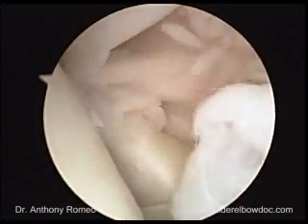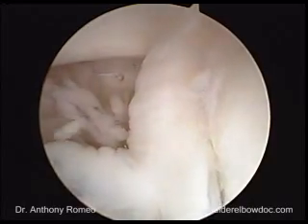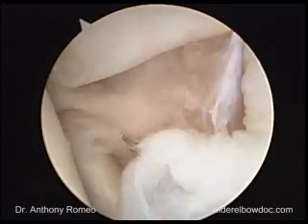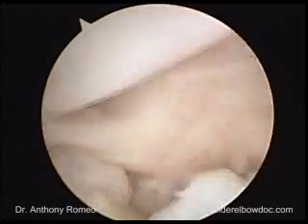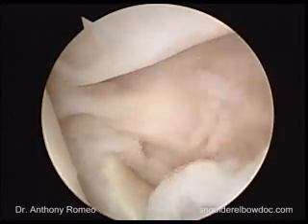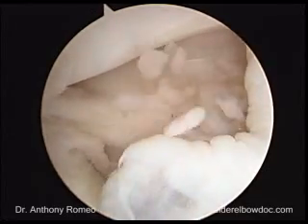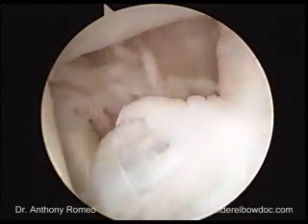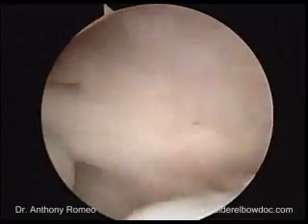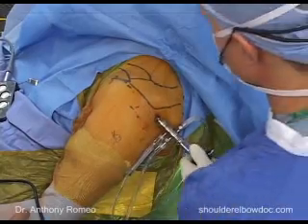Identifying the structures: there's the subscapularis, the biceps tendon, the glenoid labrum and glenoid. There's the triangle that we call the rotator interval. That band just inferior to the biceps is the superior glenohumeral ligament. To establish our anterior portal, in this case a standard anterior portal, we'll go right in the middle of this triangle and push forward with our arthroscope.